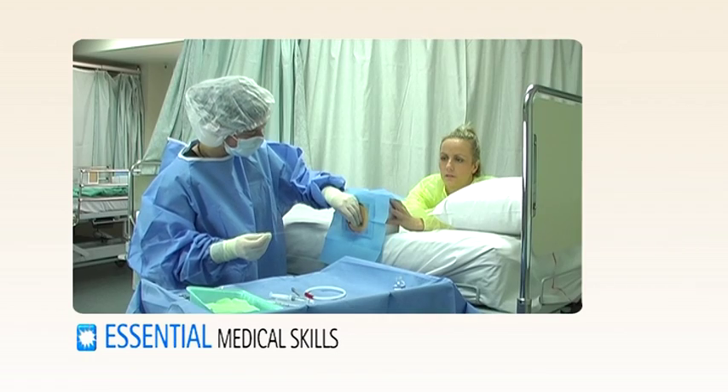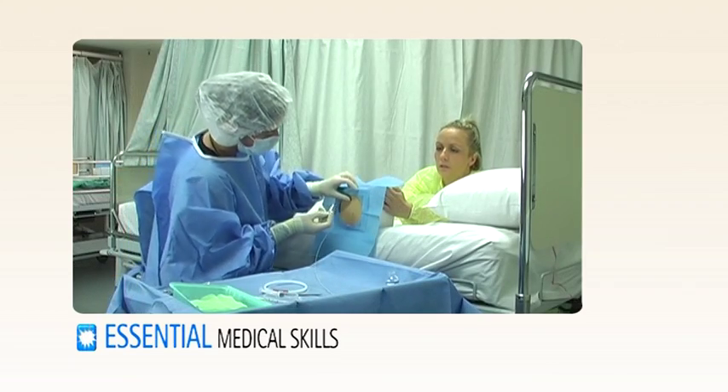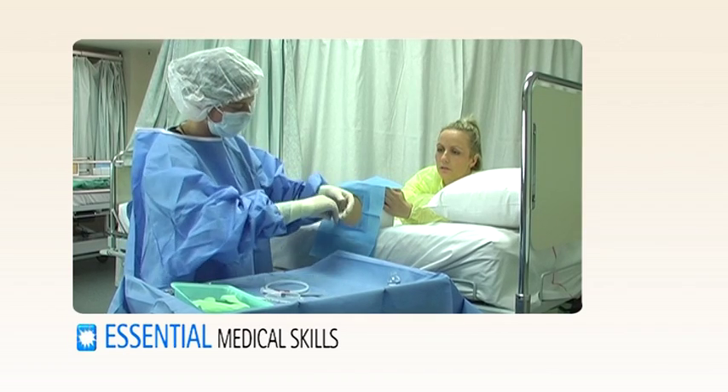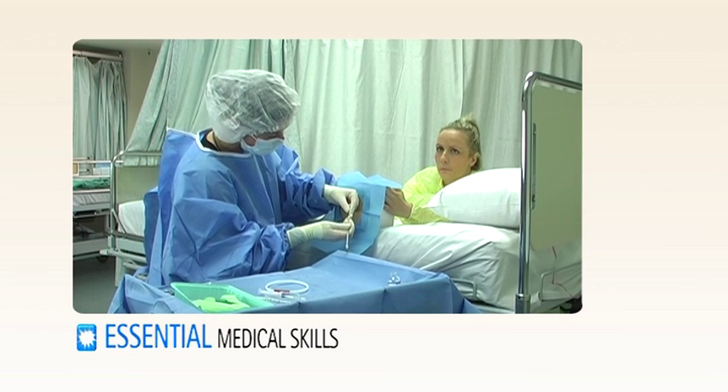Remove the needle, make a small nick in the skin next to the wire, and pass the dilator over the wire into the chest.